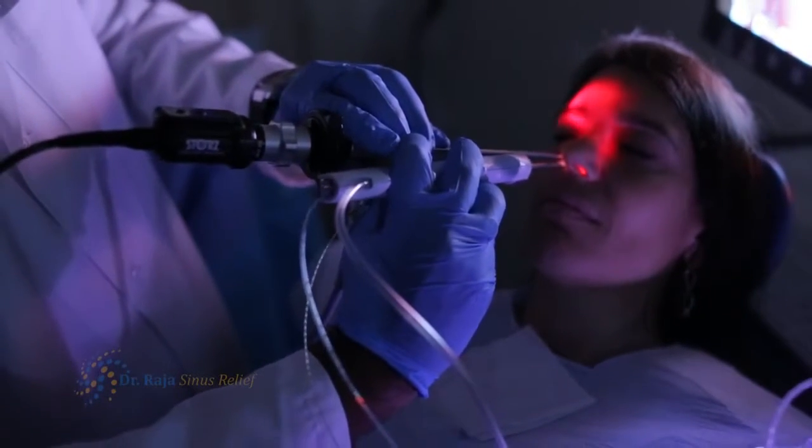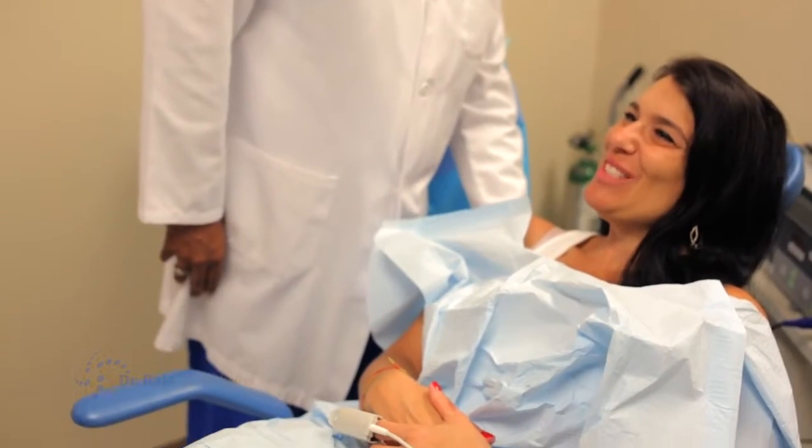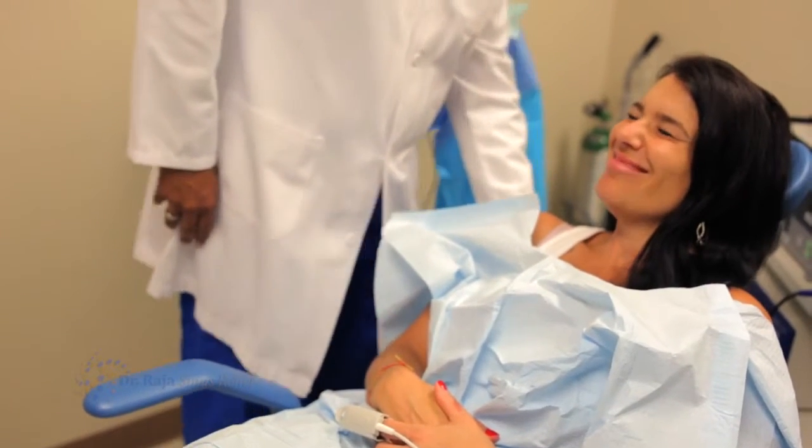So old-fashioned sinus surgery is a term that has changed over the past couple of decades as we exit each generation of the revolution of sinus surgery. So the way that the traditional sinus surgery can be viewed is a tissue-taking procedure. The difference is that we are removing tissue in traditional sinus surgery, whereas in the balloon sinuplasty, we're remodeling tissue, we're dilating openings that are already there in their natural position with as little trauma as possible. And we found in our experience the patients that have mainly nasal symptoms surrounding their allergies, even if they could be quite severe allergies, can get better with the balloon sinuplasty procedure.